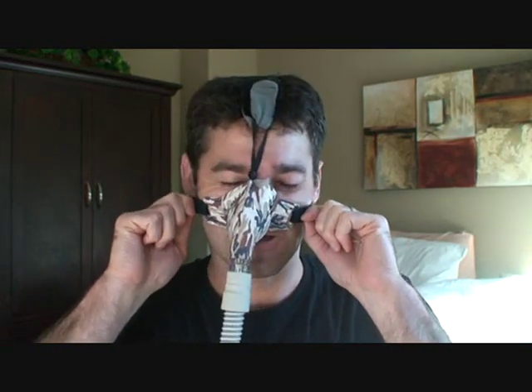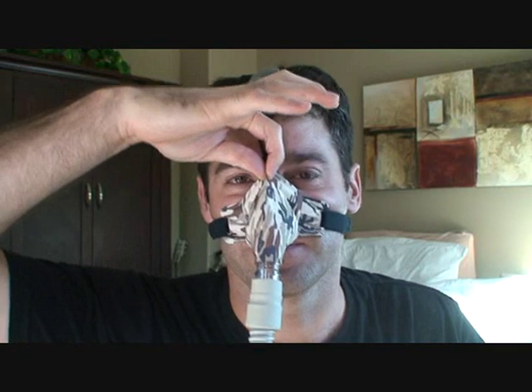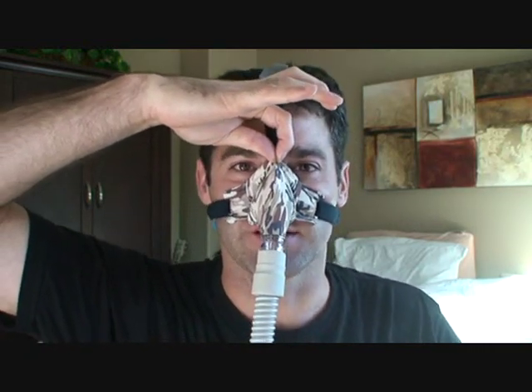What they say you can do is go side to side like this. I found that helps. Pulling it down helps slightly. But for me, pulling it up, maybe because I have such a long nose, I don't know. As far as taking it off, you can just pull it up over your ears and forward. And that way you don't have to worry about the fit for the next night. You just put it on. It's pretty stretchable material from what I just found.